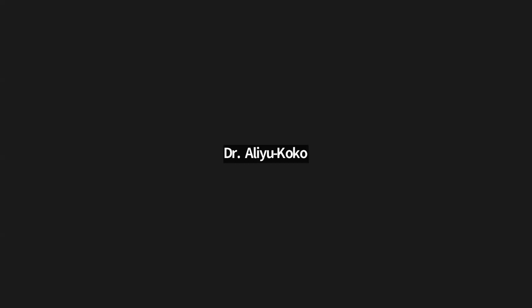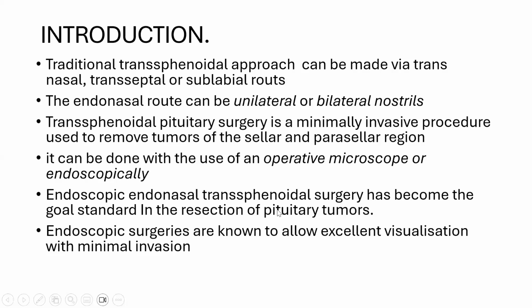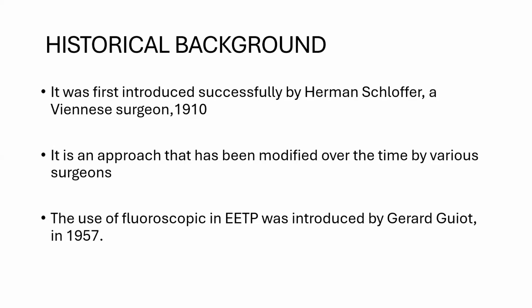Then we should also be proficient in both endoscopic and transcranial. It is a common saying amongst endoscopic surgeons that there shouldn't be boundaries to define a neurosurgeon as neuroendoscopic or open skull base. Pathology must dictate the route of access, whether endoscopic or open. And finally, we should know when to pause. We should know when to stop what we're doing for patient survival, for patient better outcome.